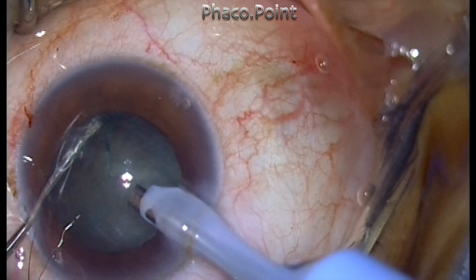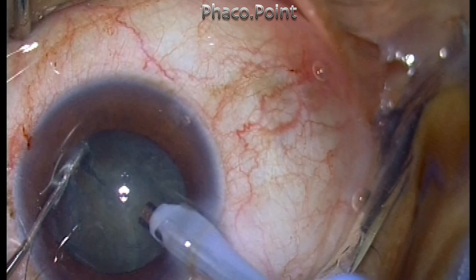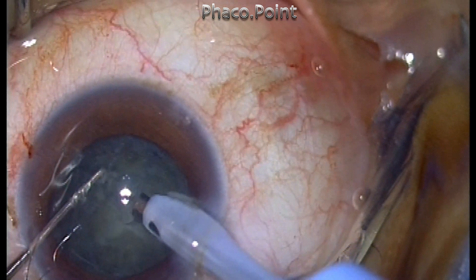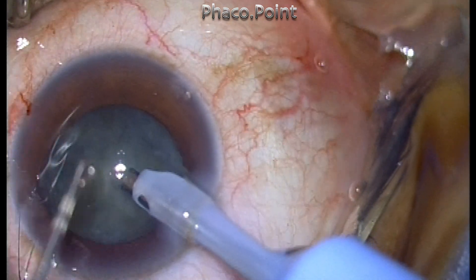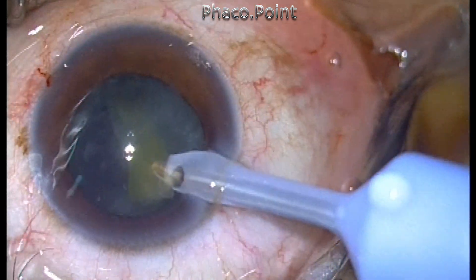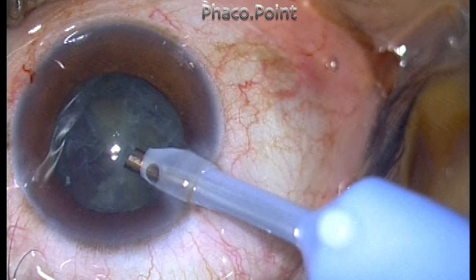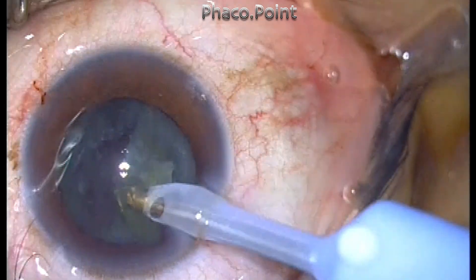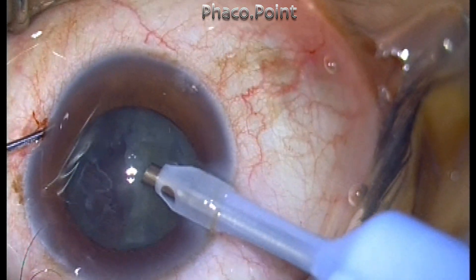As I proceeded with the direct phaco-chop and created the fragment, this of course requires a bimanual procedure — you cannot create a chop with one hand. I realized that once the chop has been created, I really don't need the second instrument at all. I could have made a second side port incision and continued, but I wanted to see if by simply using the phaco fluidics and dynamics, I can manage to do the phacoemulsification just using my phaco probe itself in a one-handed maneuver.